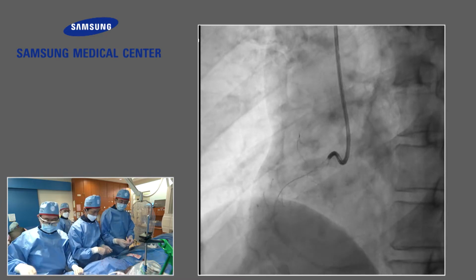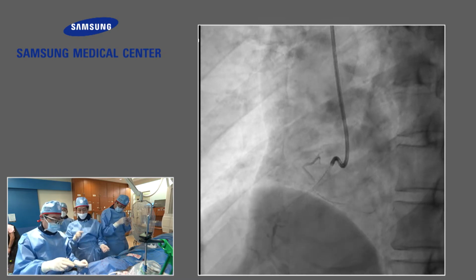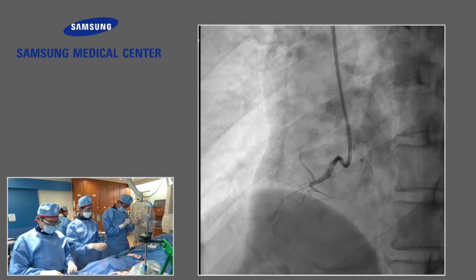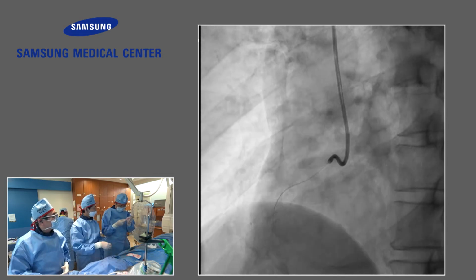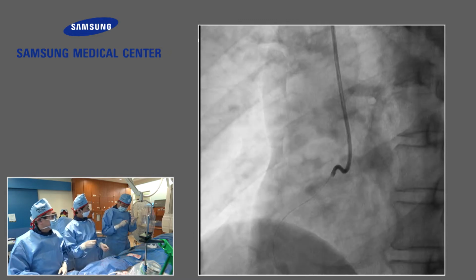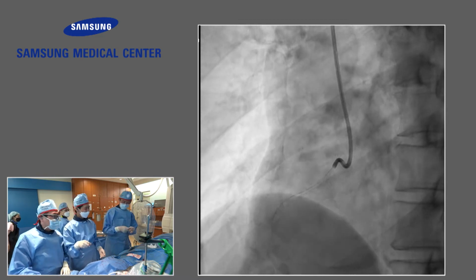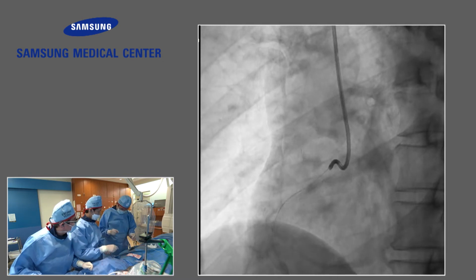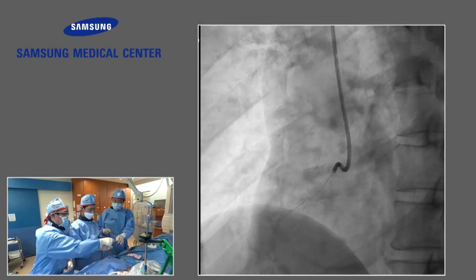I know Dr. Gwon personally very well, for about 25 years. He's really an early adopter in terms of phone and computer, but in terms of wire, he's really far behind the times. He still uses run through. But it's a very interesting personality characteristic. I do the same with the person I work with. Shall I put the Corsair in the back? Yes, give me the Corsair. No, the front one.